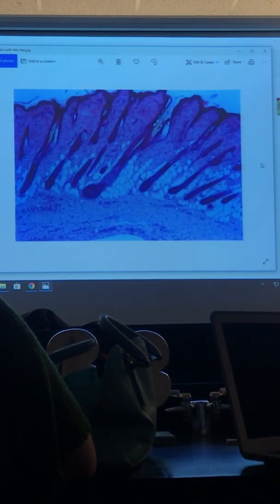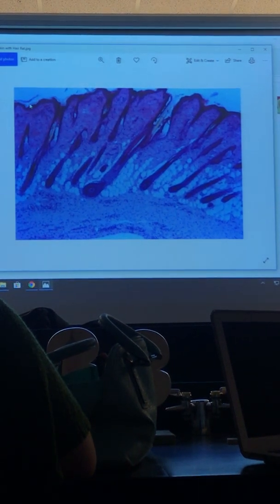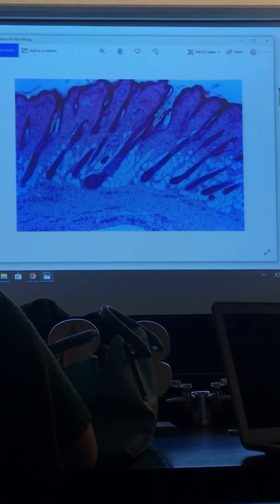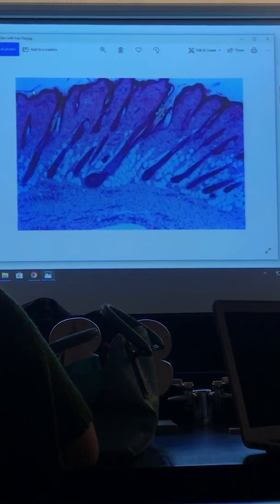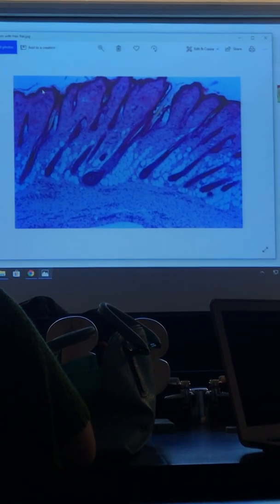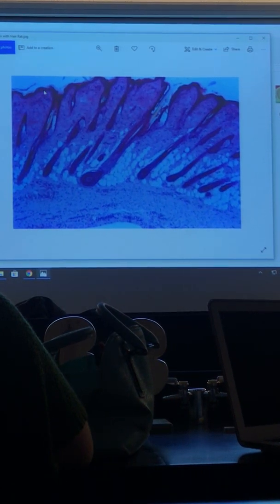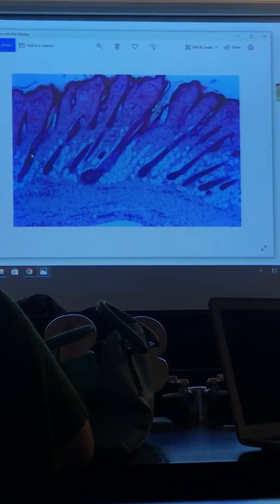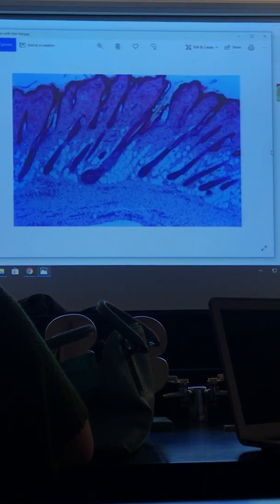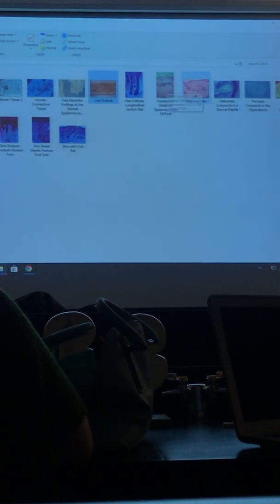Same thing. Oh, could I do that? Yeah, I guess I will. That's stratum corneum. That's it. You've heard of dandruff? So stratum corneum would be like flaking off. That is stratum corneum. That's it. There's stratum spinosum. You can't see granulosum or basale to speak of. So that's epidermis, that dark purple. The rest of this is dermis. Then we get into hypodermis and other tissue that we will talk about.